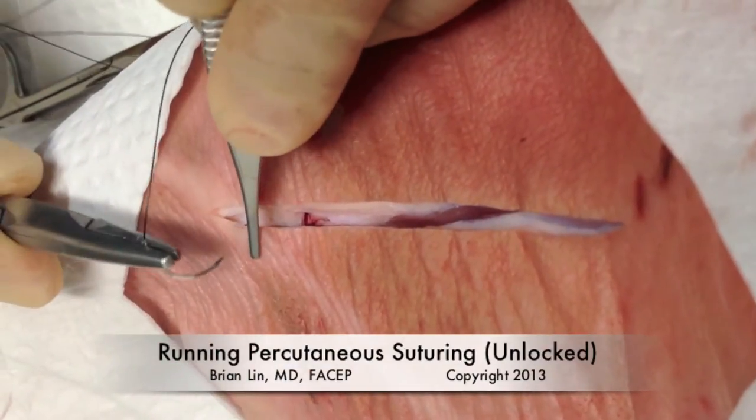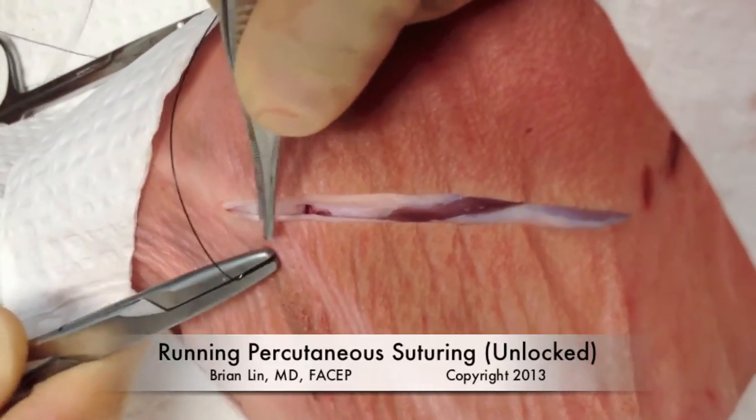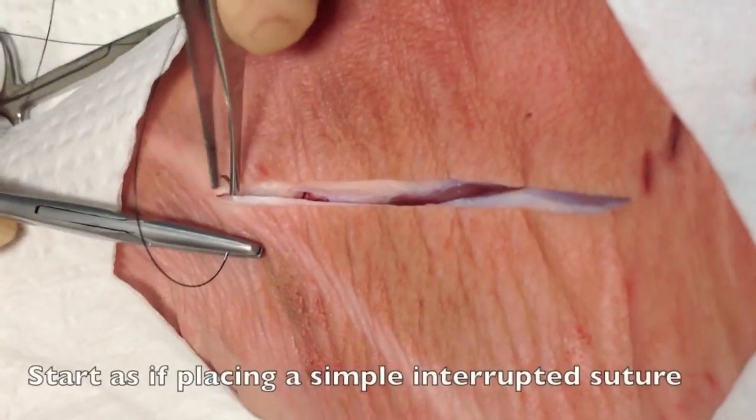Here's an example of the running percutaneous suturing method without locking. The idea is that you're going to use one continuous suture to close the wound before you divide the suture material.